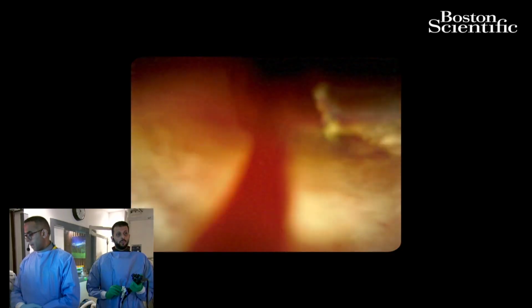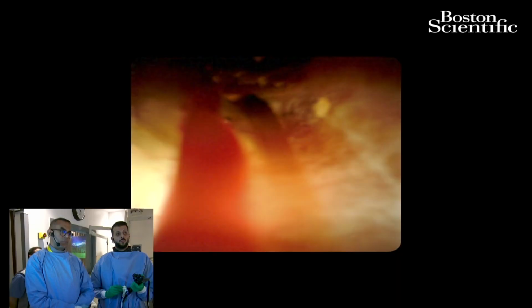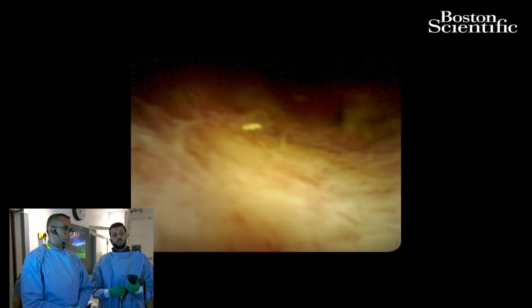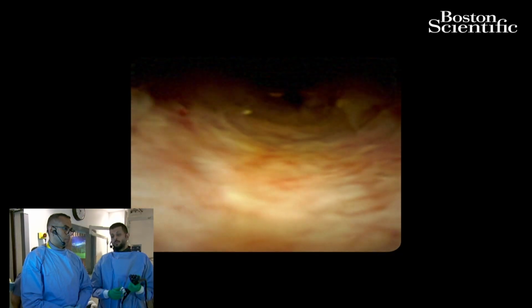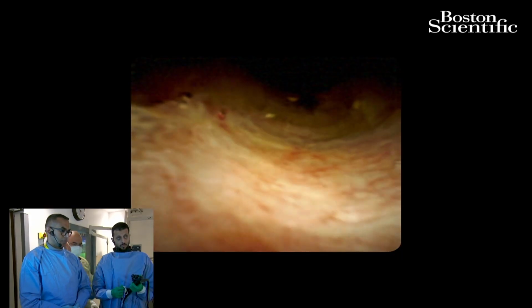So if he had the cholecystectomy 30 years ago, and then he has a stricture now, Ahmad and all the people are right to do a spyglass, against what I said in the beginning. The problem is that he has a very old cholecystectomy, 30 years, and now they find a stricture.